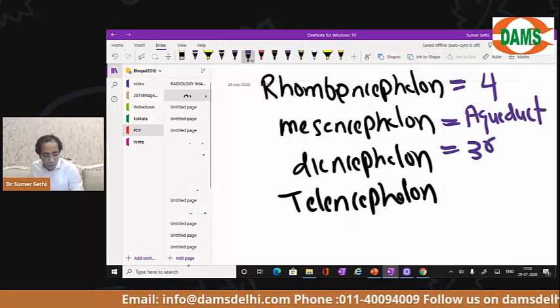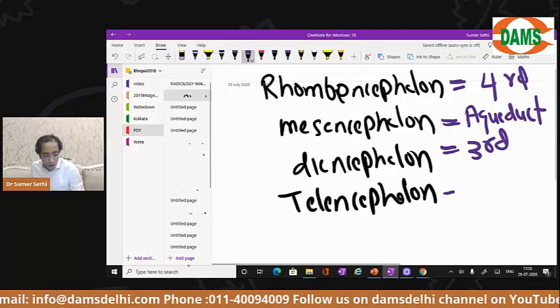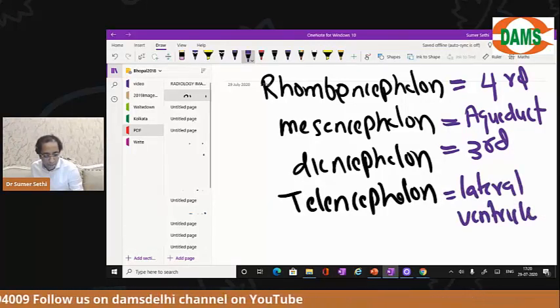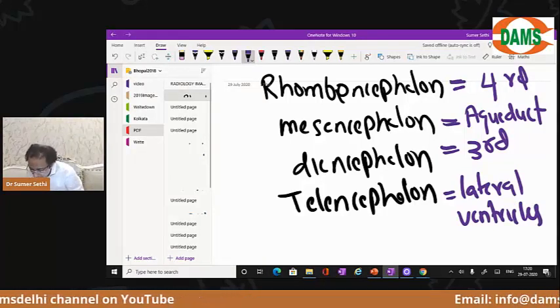In the diencephalon, you will see the third ventricle. The telencephalon has the lateral ventricles. Okay. Are you clear? Because I want you to be clear.